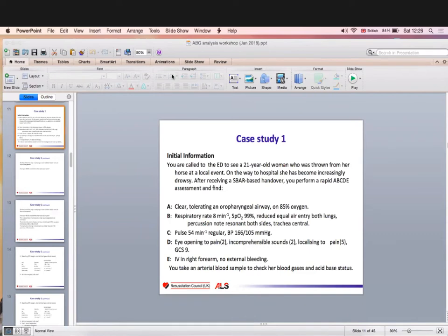Okay, why did you put 100, 150? Now she's on 85% oxygen, but on 85, she's achieving 99%. Okay, fine. So there should maybe be a poor oxygenation. Okay, fine. Then bicarb. Slightly low, 22, 21, 20.